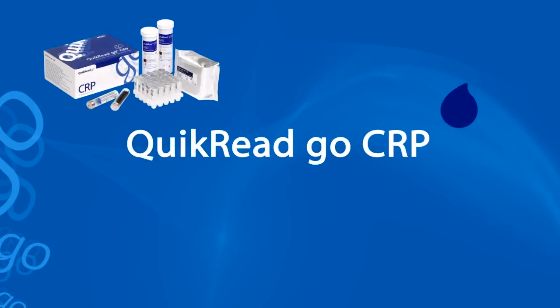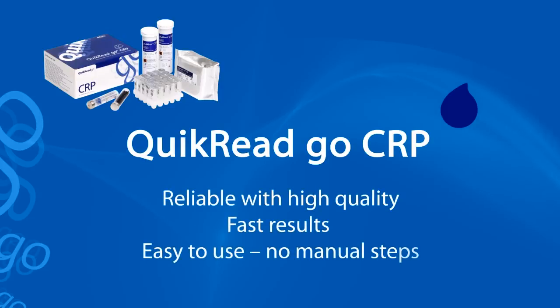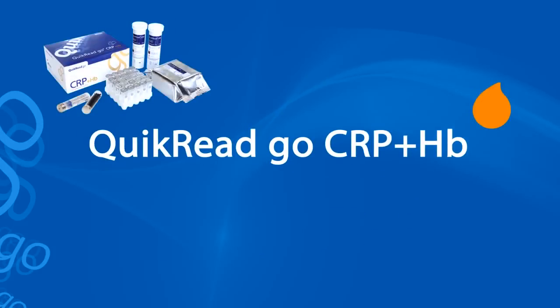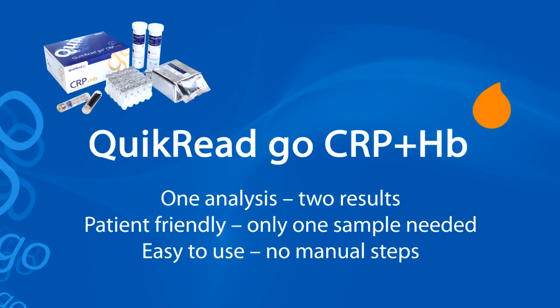Quick Read Go CRP test is reliable and of high quality. Results are comparable to laboratory test results. It's easy to use — no manual steps are needed and the hematocrit correction is automatic. Quick Read Go CRP plus HB test gives reliable CRP and hemoglobin results with a single analysis. The need of just one sample minimizes the patient's discomfort, and there are no manual steps with the Quick Read Go instrument.